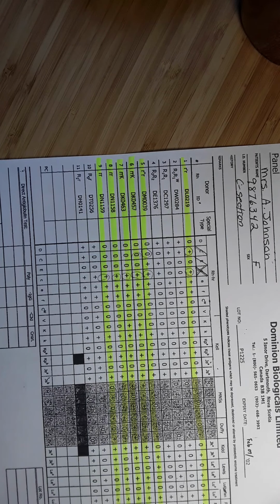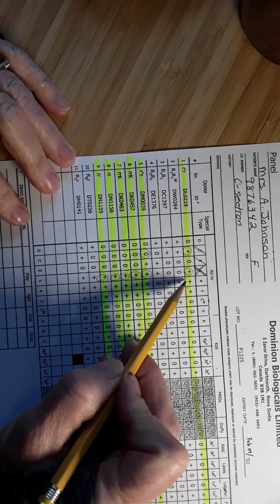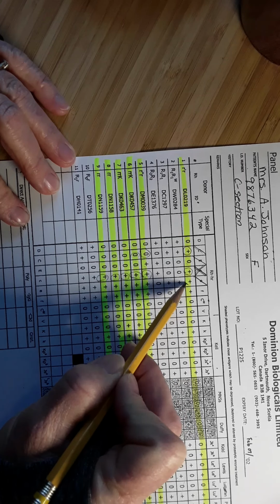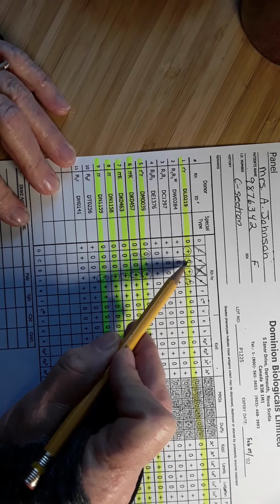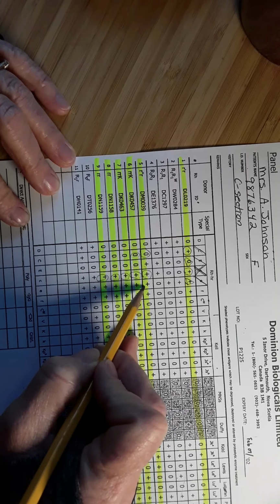Maybe I'll just do little e just to finish it off. Okay, so little e, here I've got a little e positive cell that did not react. I'm going to put a slash. And I'm going to make note, this is a homozygous little e cell, right? It's positive for little e and negative for big E. Continue down the column. Oh, there's another little e positive cell that did not react.